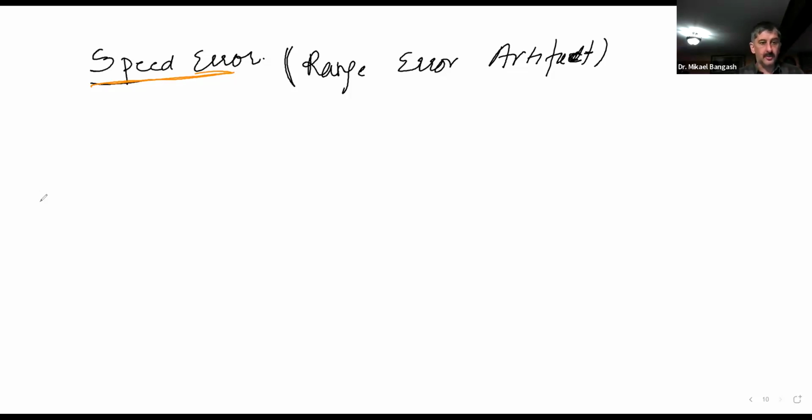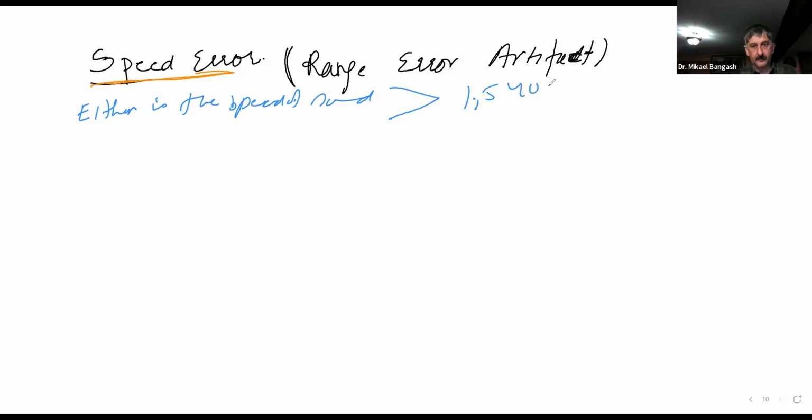Okay, guys. Now the main two things that can happen is either the speed of sound in soft tissue is greater than 1,540 meters per second.